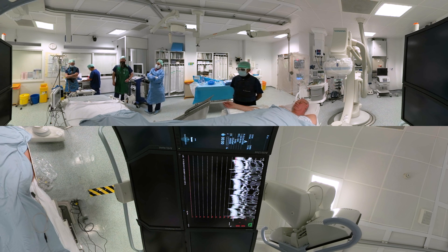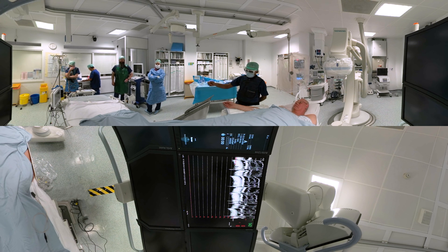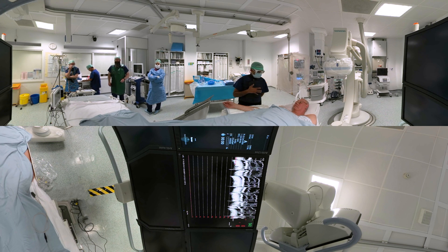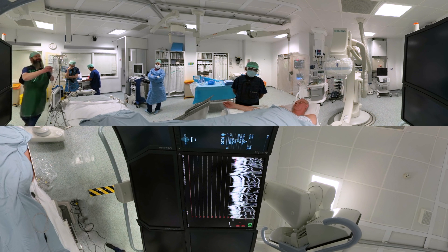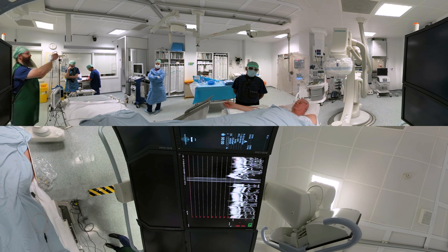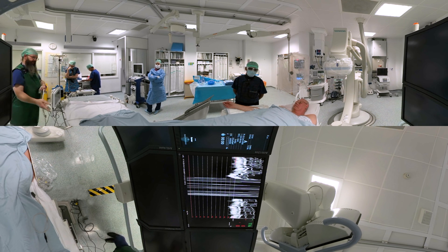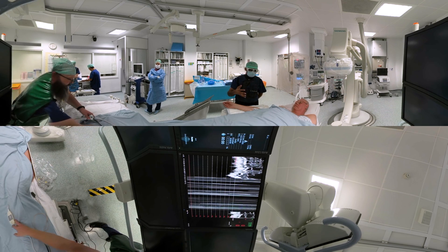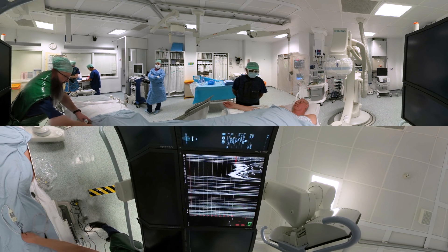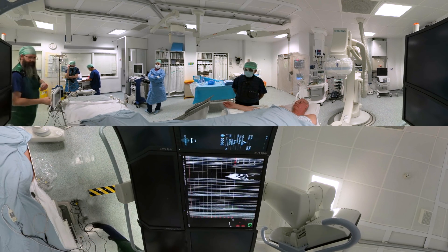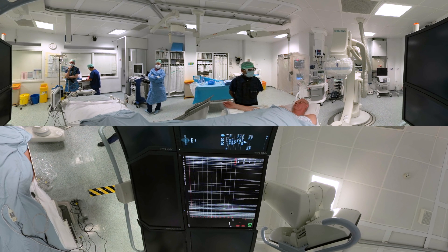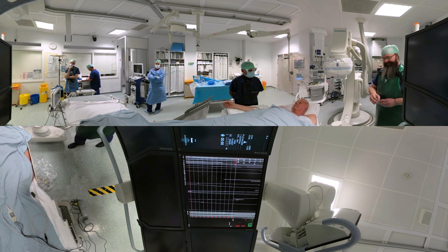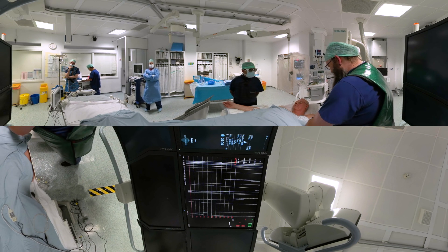The first thing that's going to happen is that the physiologist Terry is going to put some ECG electrodes on the patient's chest, and that's to monitor the heart rhythm during the procedure. We're also going to put on some oxygen monitoring and monitor the blood pressure. Terry, if you could come in and connect those ECG electrodes up please, thank you.